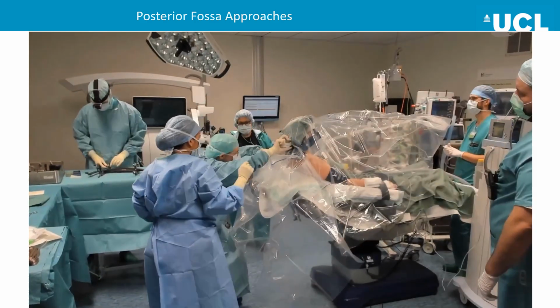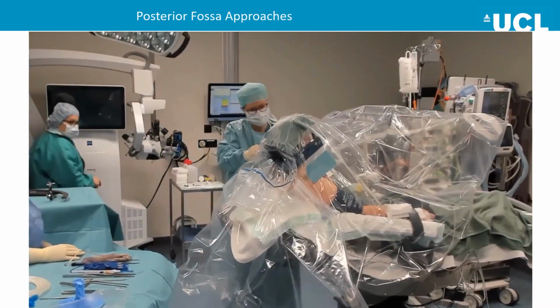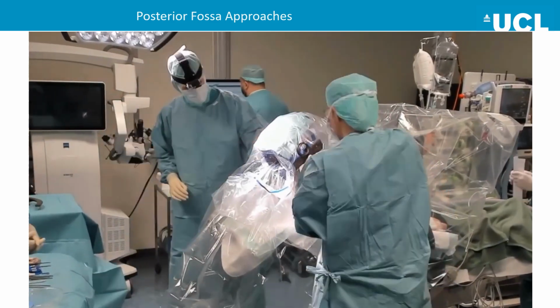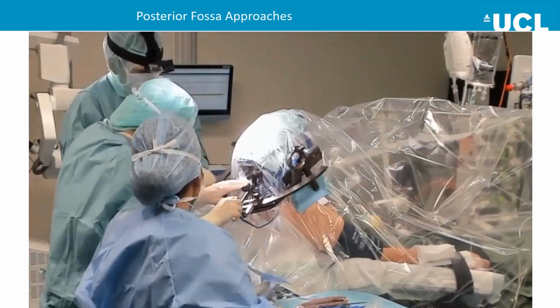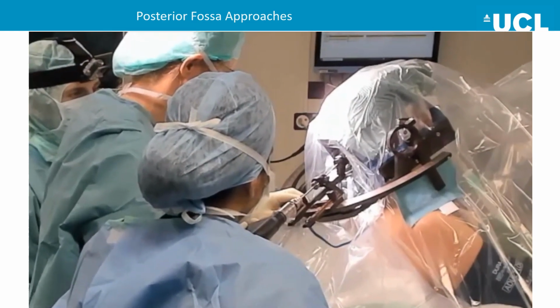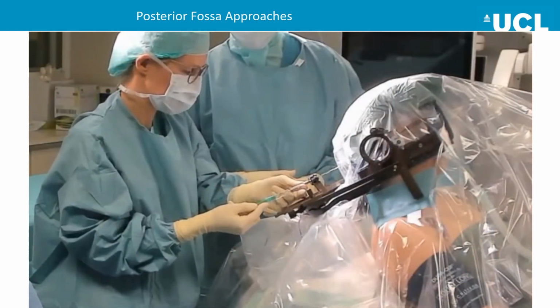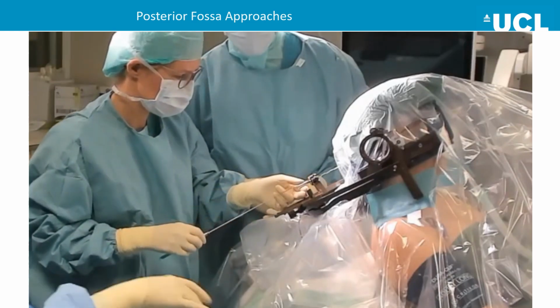And now here you can see the setup in the OR. We usually operate on the patients in a semi-sitting position. Once you've got feasible coordinates, everything after that is really just easy sailing from there. You just program the frame and then you can do your biopsy or whatever you need to do through the posterior fossa.